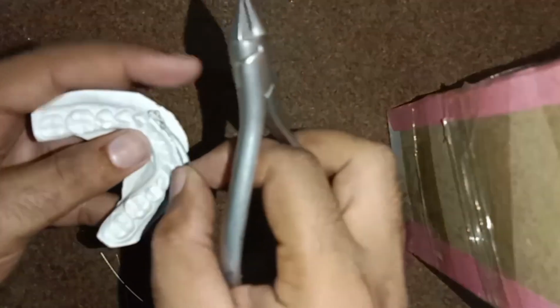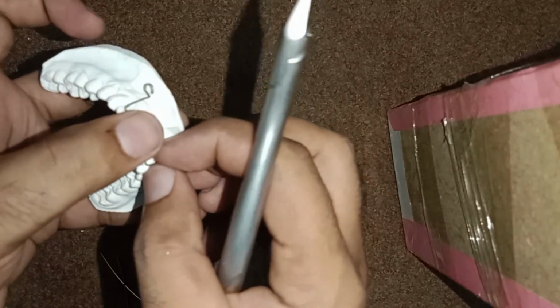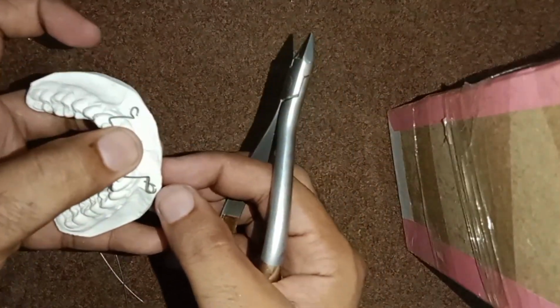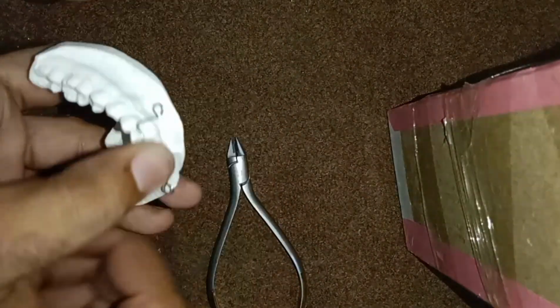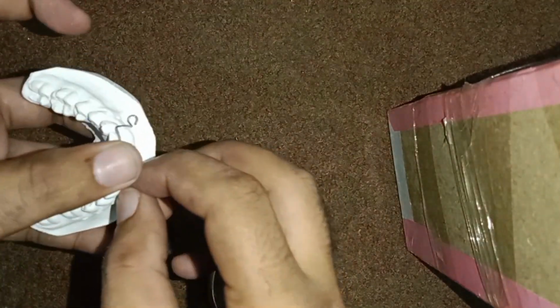We will place this wire in the anterior incisors and ligate it in the brackets. Now we have right side and left side. This is one piece of the intrusion arch, the 3-piece intrusion arch.